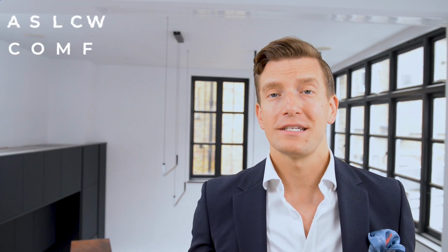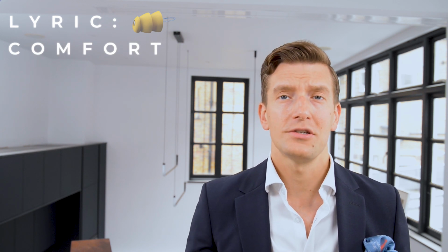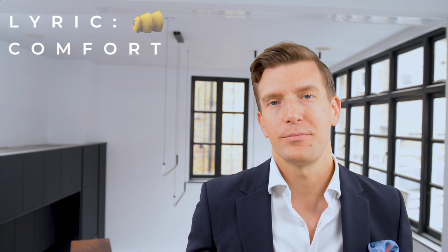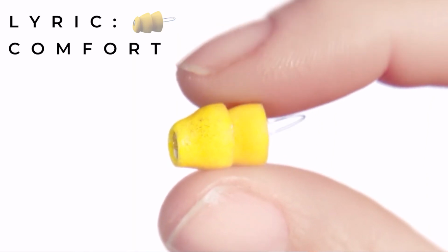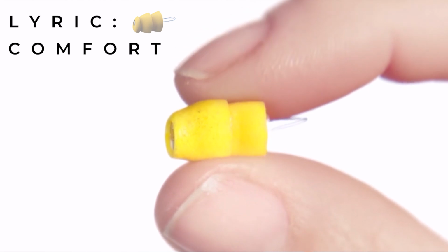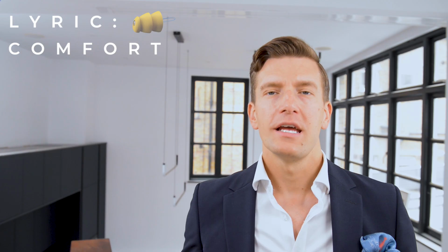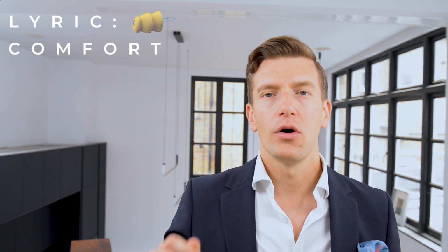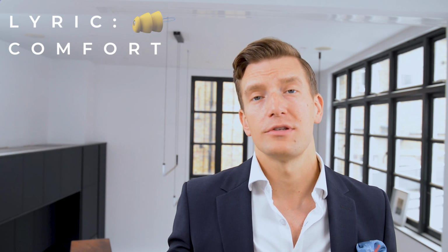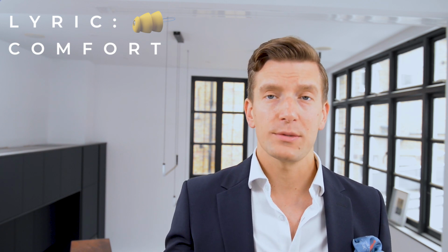The Lyric itself weighs next to nothing, which makes sense as after a couple of days, the sensation of its presence should completely disappear from being in your ear. The torpedo design is made as such to allow it to fit most ears, and the two seals still allow your ear to breathe even with the Lyric in situ. The extra small has a third seal for another layer of comfort, and on the version 4 upgrade that we saw at the tail end of 2020, we've seen an improvement in terms of the wax protection system on both the microphones and the speaker.